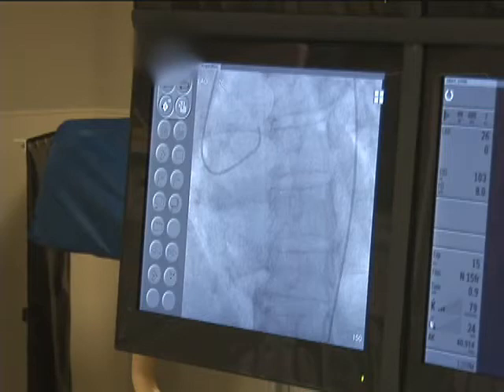The hemostatic adapter is opened to allow bleedback to further verify the absence of air bubbles or plaque within the guiding catheter, and the entire system is flushed with heparinized saline, following which the hemodynamic system is zeroed. Once zeroed, the transducer is opened and central aortic pressure is transduced from the patient.